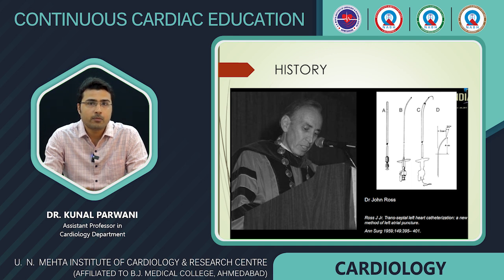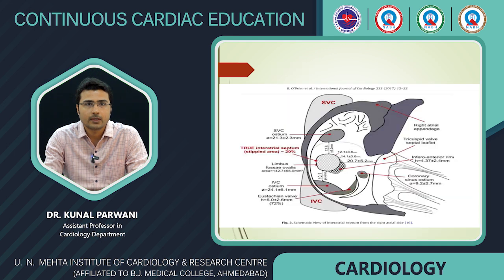Mullins developed a combined catheter and dilator set designed precisely to fit over the Brockenborough needle, which gives a smooth taper from the tip of the needle over the dilator and helps us in performing a safe transseptal puncture. Before performing a safe transseptal puncture, it is very important to know the proper anatomy of the fossa ovalis.